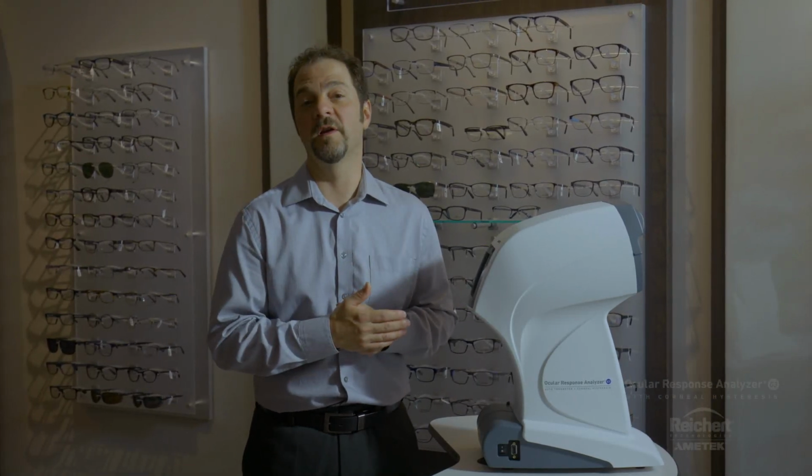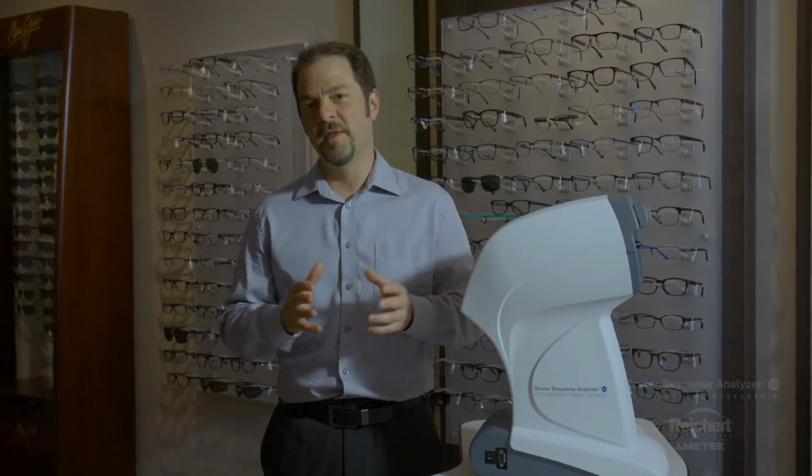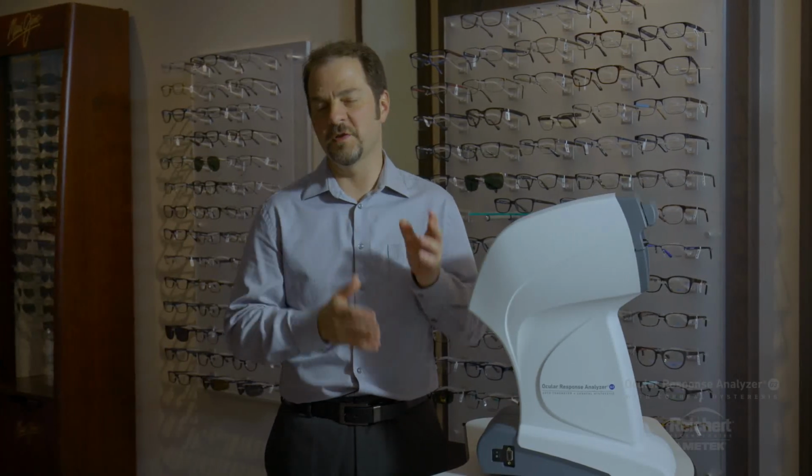So let's talk about the IOP-G measurement, however. The IOP-G measurement is supposed to be essentially a Goldmann equivalent, and dozens of clinical studies have concluded that the IOP-G measurement from this device is highly correlated with actual Goldmann tonometry measurements. But correlation does not constitute 100% agreement. In fact, no two tonometers will ever read exactly the same on any particular patient's eye in all cases. So if you see small differences between this IOP-G value and the Goldmann measurement in your practice, that should be considered normal. And you would expect to see that this measurement will agree with Goldmann tonometry plus or minus 2 or 3 millimeters of mercury in a large majority of cases.